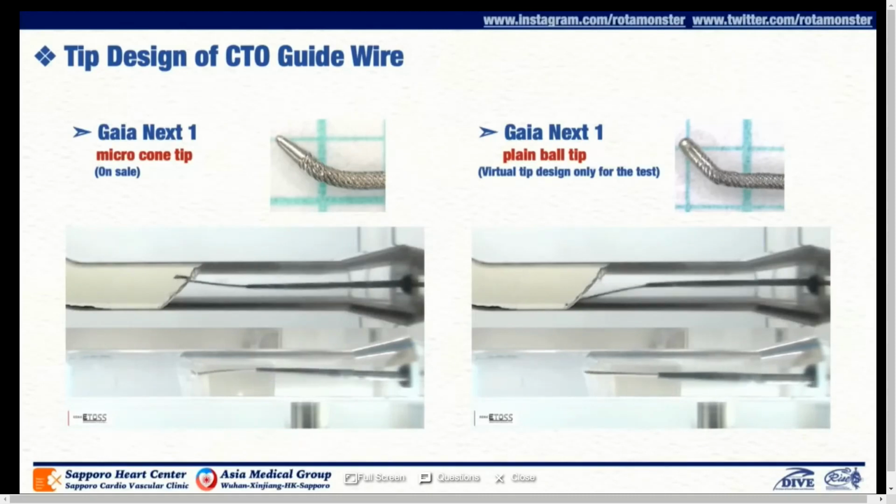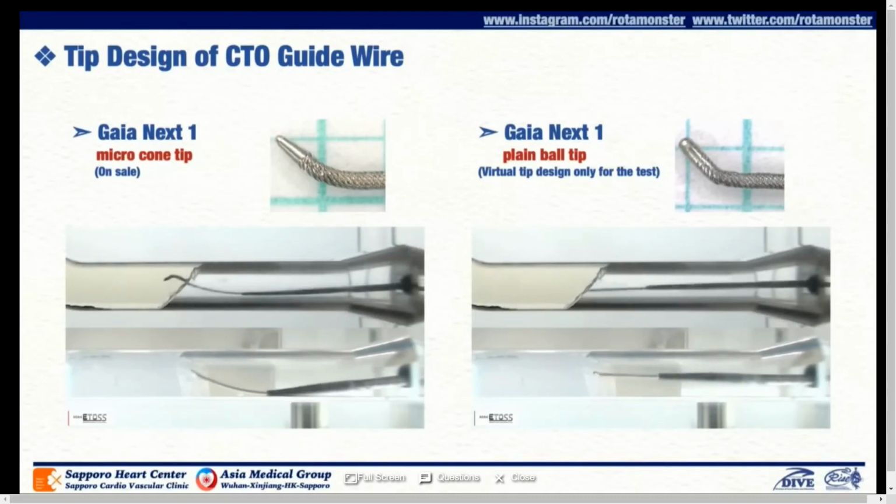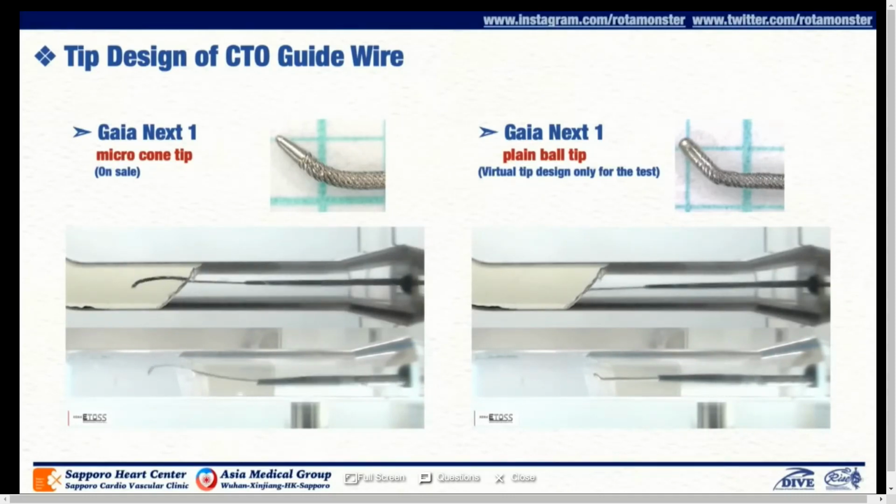As you can see, tip design alone has a big impact on the wire manipulation of penetration. Therefore, when considering the penetration effect, the wire selection should include not only the tip load but also tip design.